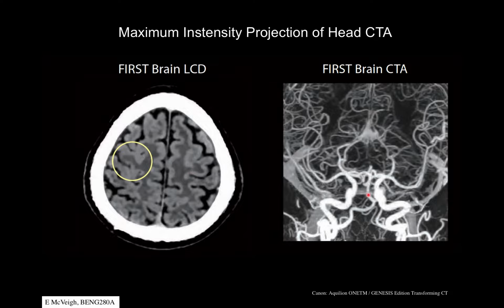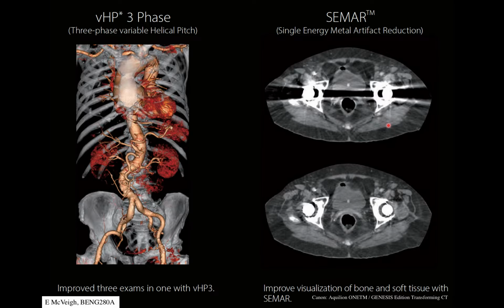This is an image that is a maximum intensity projection of vessels. So when you inject contrast into the bloodstream and then image the brain, you can appreciate all of these small vessels perfusing the brain. So if you're looking for something like an aneurysm, like a large distension of the vein, or some area where there's a blockage and downstream of that blockage is blocked off, it's a really good imaging modality. It gives you very high resolution 3D imaging data.